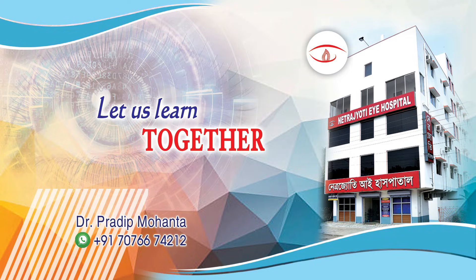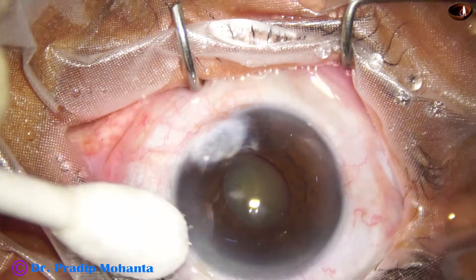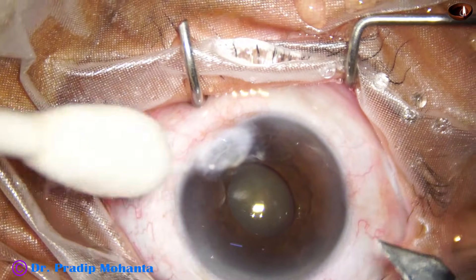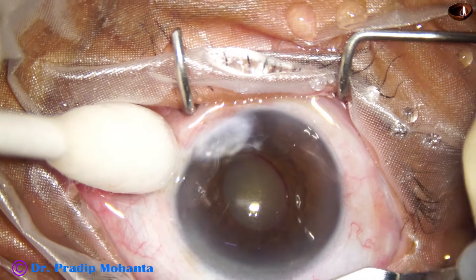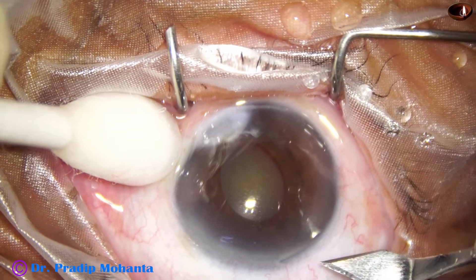Friends, welcome to my workplace at Ranaghat, West Bengal, India. Let us observe this minimally edited surgery. This patient has cataract in both eyes, nuclear sclerosis about grade 4.